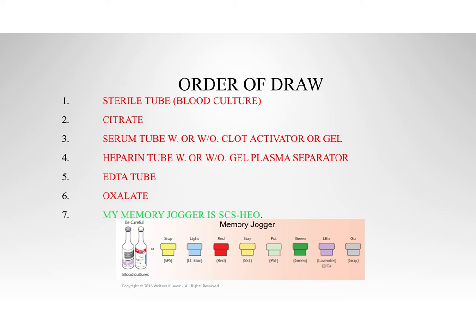Sometimes we use tubes because I don't want any regular contamination from a regular tube that sits out all day to be in my blood culture bottle, because they're not going to wait for that machine to identify the organism. Once it pops positive that there's an organism or a bacteria inside that bloodstream, they automatically start heavy antibiotics because they believe you have sepsis.